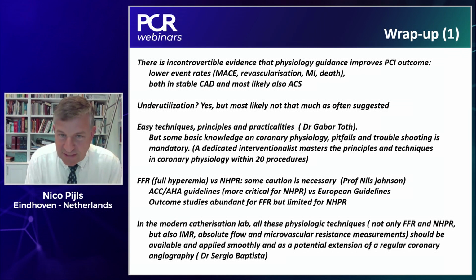Gabor has taught us that the techniques in themselves are easy, not very difficult, and he has elaborated on the principles and the practicalities. Of course, some basic knowledge of coronary physiology is mandatory. You need to be aware of some pitfalls, and some troubleshooting is also mandatory. But I would say that a dedicated interventionalist can master the principles and techniques in coronary physiology within, let's say, 20 to 30 procedures.